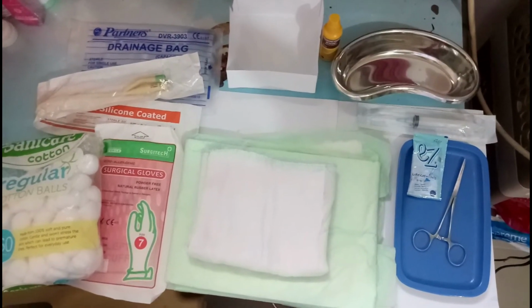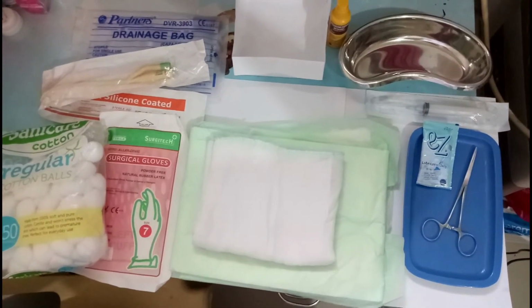So after washing my hands, I'm going to select the specific type and size of catheter to be used. In the doctor's order, it is an indwelling catheter. So now I'm going to get the Foley catheter. For the equipment, I have already prepared my equipment needed.